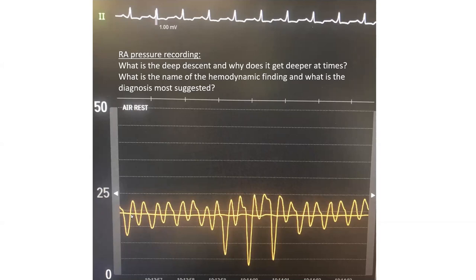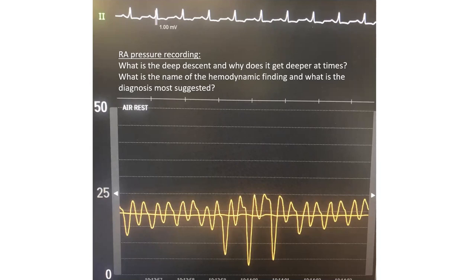So the way you start: you see a high RA pressure, around 18 mmHg. Whenever you have high RA pressure outside tamponade, you will get deep Y descent during inspiration. You can try to time that descent and prove it is Y. Y comes after V and V comes after T. So this is V and this is Y. Even without the EKG, with high RA pressure, the deepest descent is the Y descent and it's deeper during inspiration.